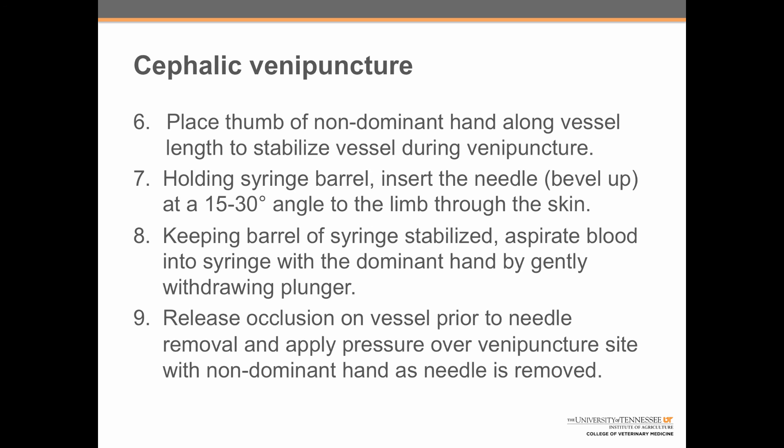Step seven: holding the syringe barrel with the dominant hand, insert the needle bevel side up at a 15 to 30 degree angle to the limb through the skin, then flatten it out while advancing into the vein. Step eight: keeping the barrel of the syringe stabilized, aspirate blood into the syringe with the dominant hand by gently withdrawing the plunger. Step nine: instruct the handler to release occlusion on the vessel prior to needle removal, then apply pressure over the venipuncture site with the non-dominant hand as the needle is removed.